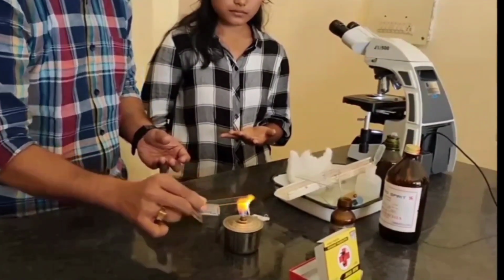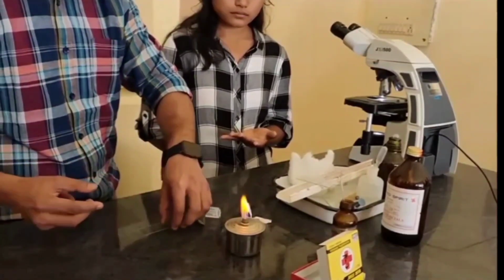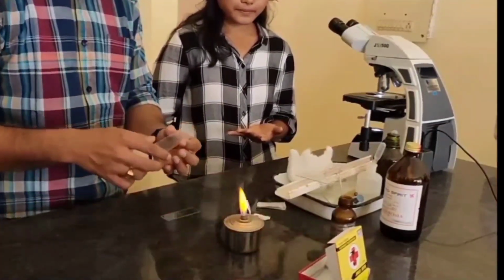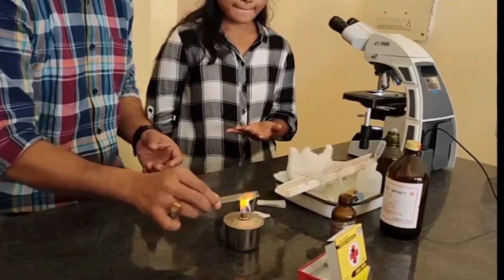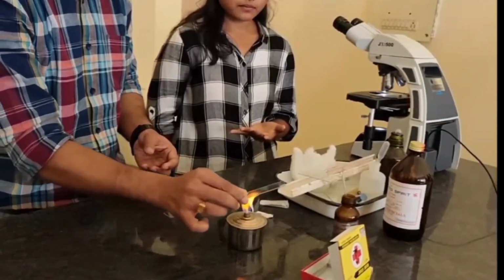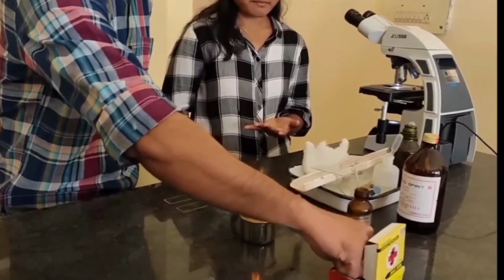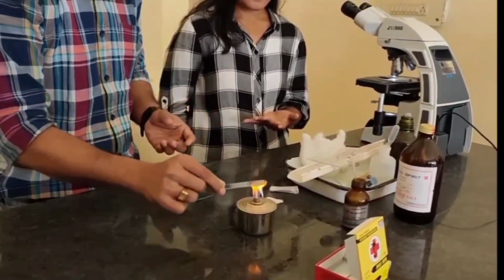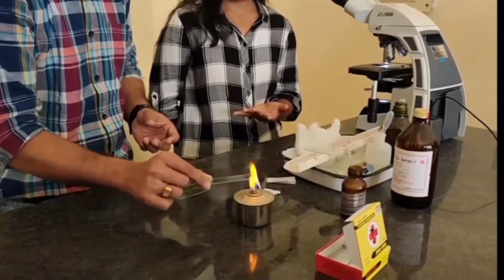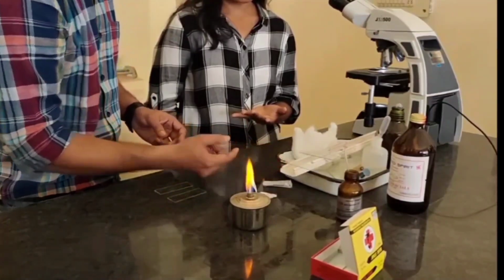We have cleaned with the spirit soap. That surface we should use after it cools down. Yes, I'm going to use that particular surface which is already cleaned, first with soap and water, and then over the flame. See here, I'm cleaning this other slide, and the surface I have already cleaned over the flame, I'm going to use that surface. And this slide I'm going to use as a spreader.